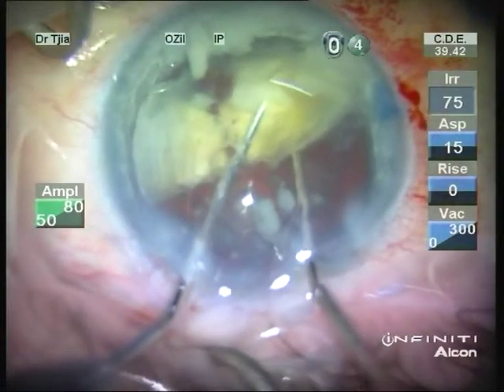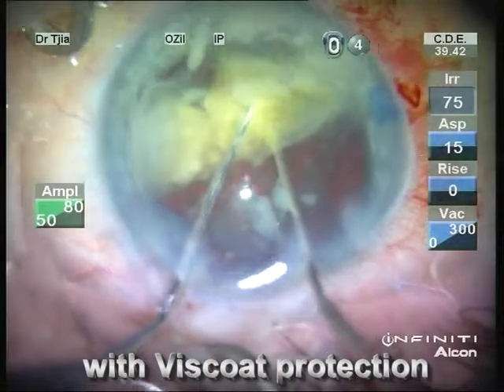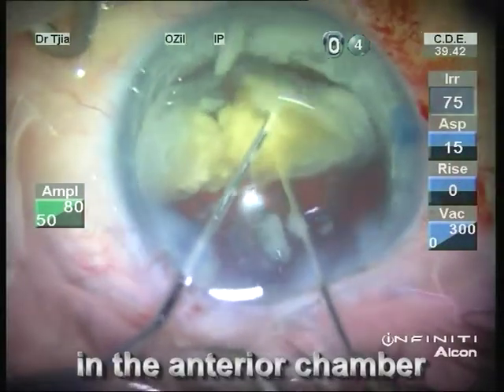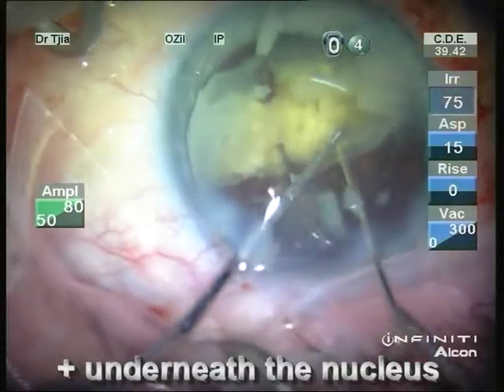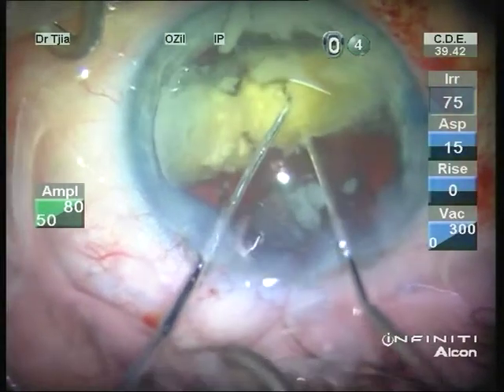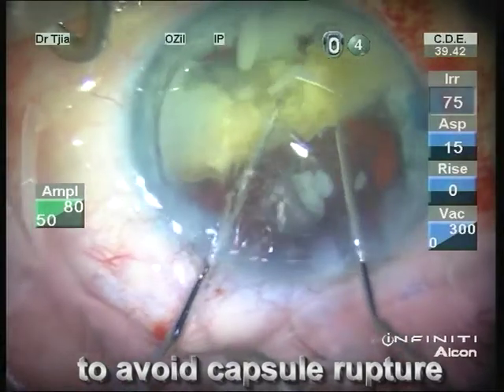With the nucleus completely surrounded by viscoelastic both on top of the nucleus in the anterior chamber, as well as underneath the nucleus to protect the posterior capsule, in order to avoid an inadvertent capsule rupture.